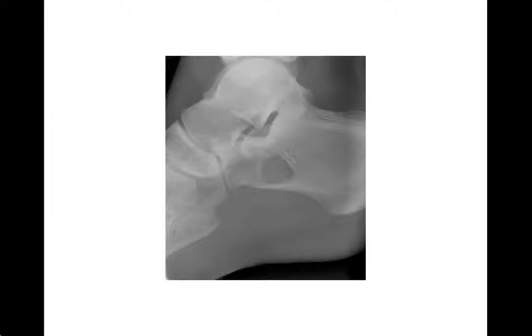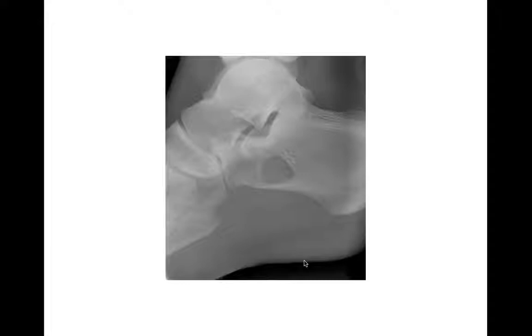This is a radiograph of the calcaneus. There are two main calcaneal tumors you're going to see which occur in the anterior part of the calcaneus. Drawing a line bisecting the calcaneus, anterior is one half and posterior is the other. When you see lytic lesions in the anterior part, there's two main things to think of.